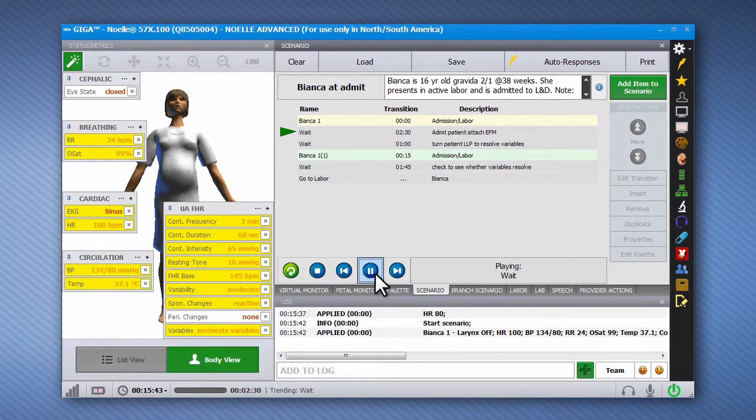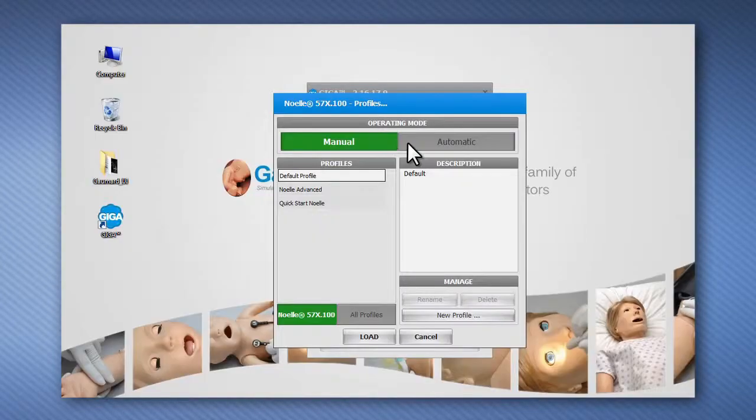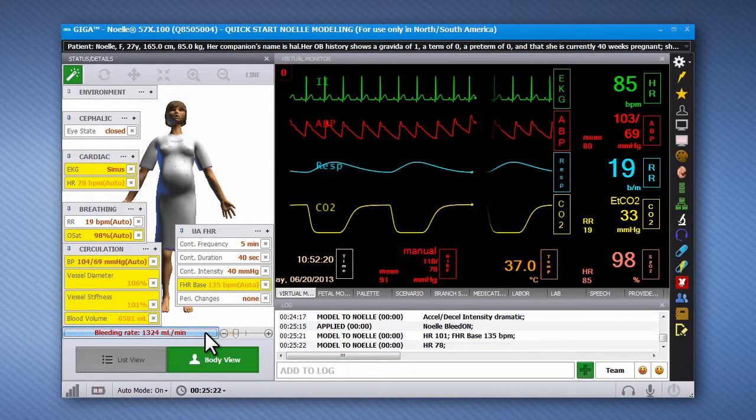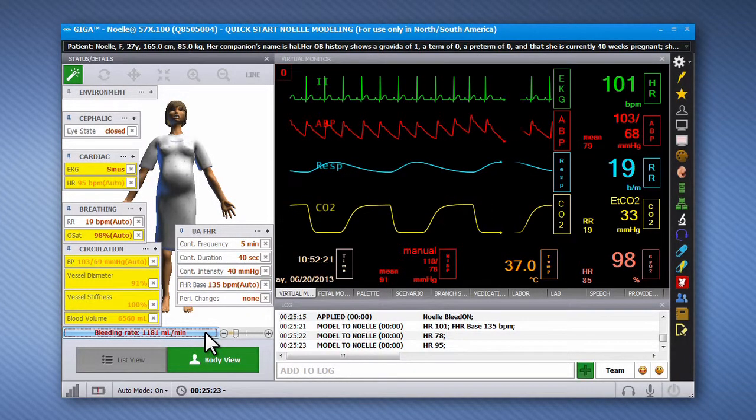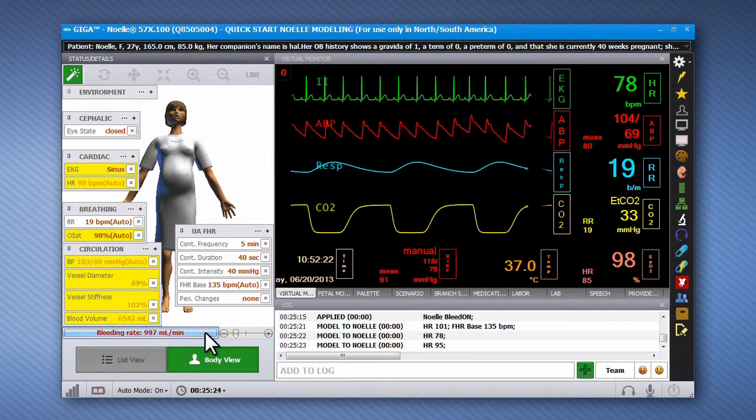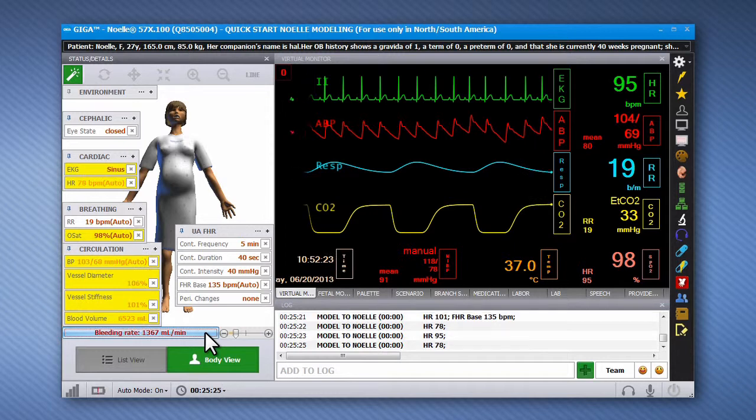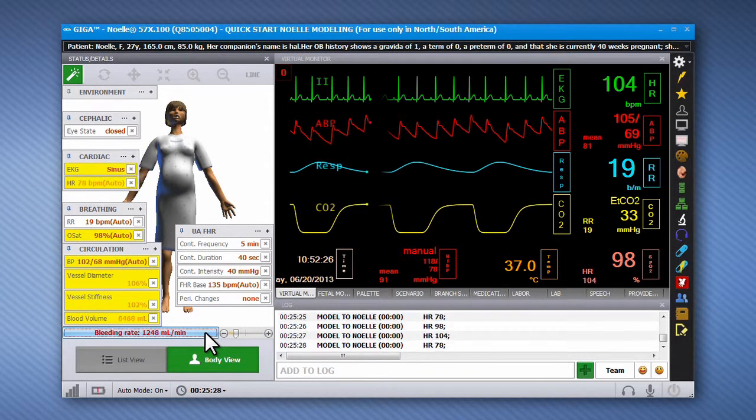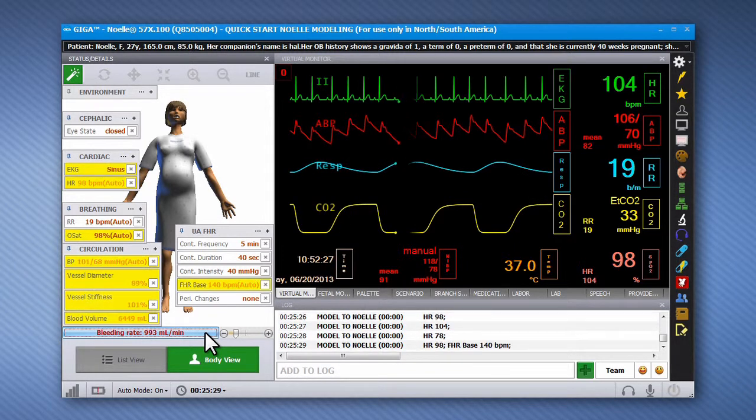The automatic mode upgrade assists the operator by updating the patient's condition in response to the care provided by the participant, medications administered, or manual input using the software controls.